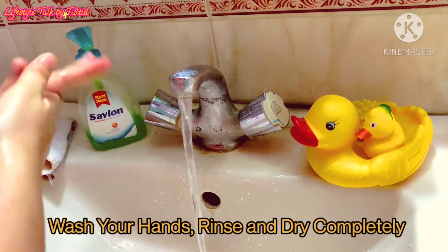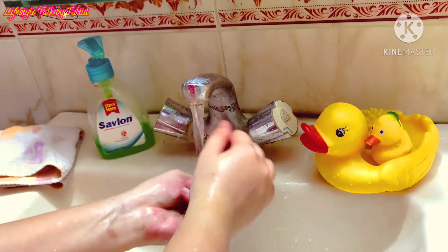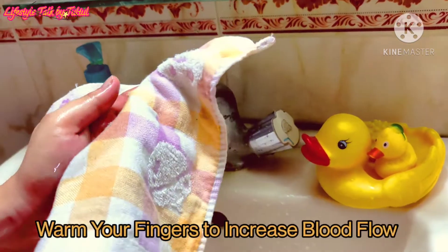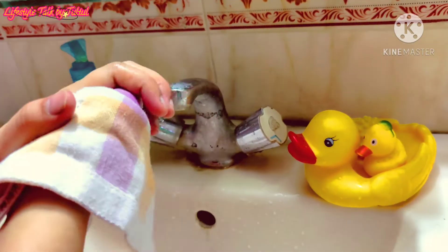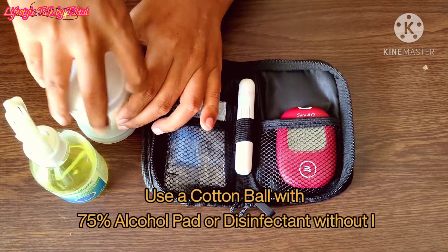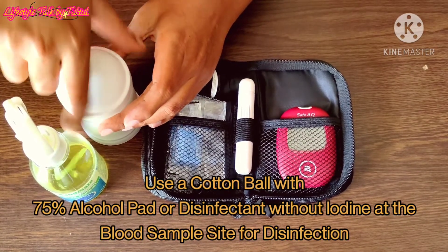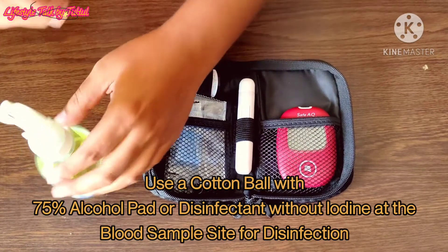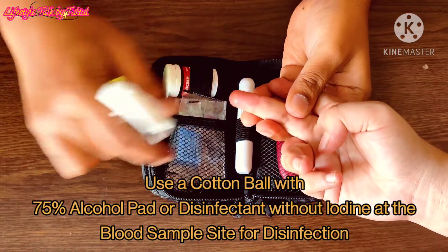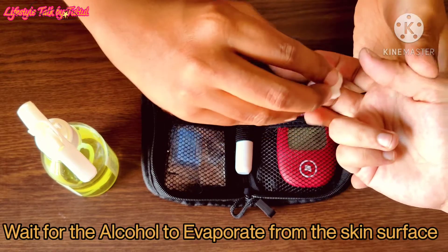Wash your hands, rinse and dry completely. Warm your fingers to increase blood flow. Use a cotton ball with 75% alcohol pad or disinfectant without iodine at the blood sample site for disinfection. Wait for the alcohol to evaporate from the skin surface.